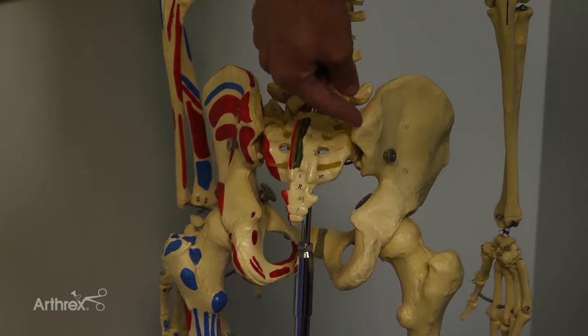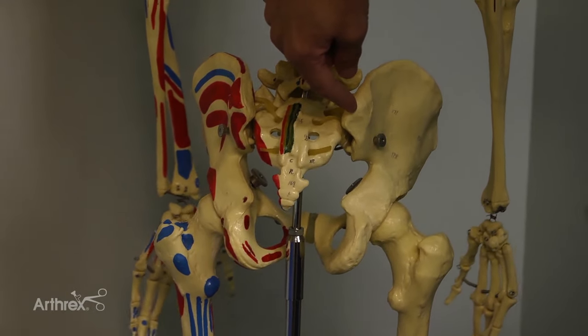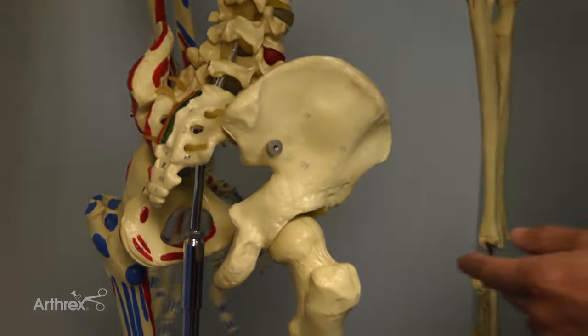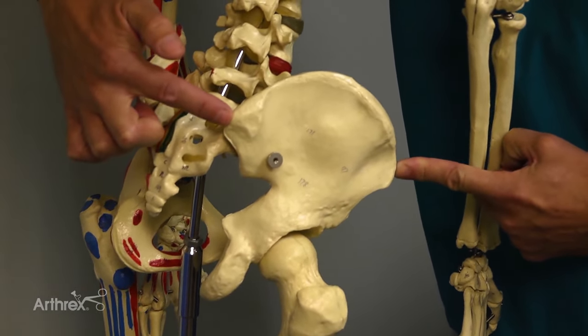Typically what I tell people is that you're aiming for the anterior superior iliac spine. So when your needle is on this posterior superior iliac spine, you're actually aiming for the front — aiming for the ASIS — and that'll be your direction as you get through the bone. Once you're through the cortex of the bone and you're in the marrow, the bony cortex is going to direct your needle and won't let it go out of the cortex. It'll keep it within the cortex itself.